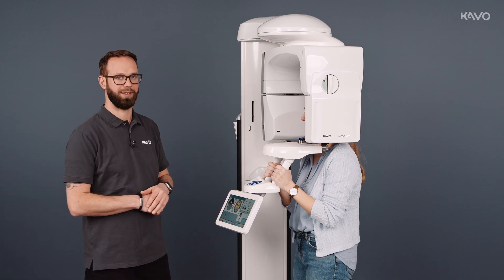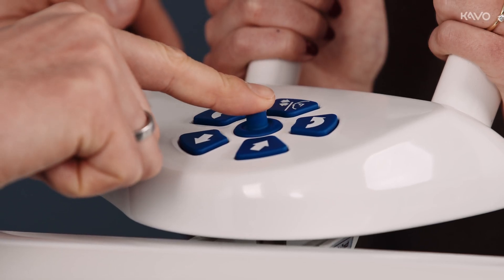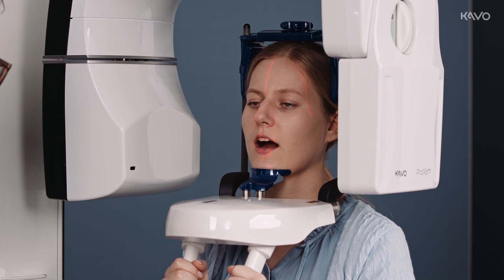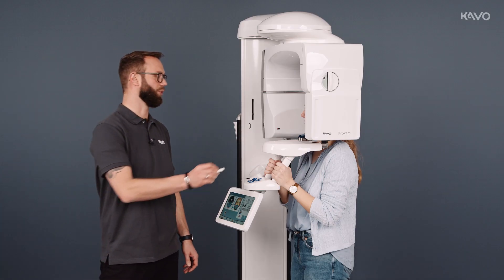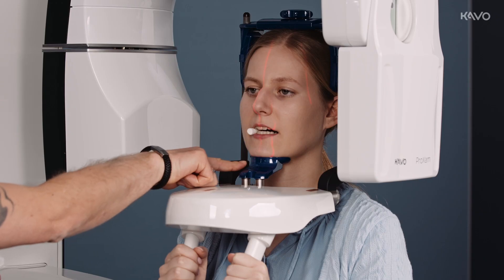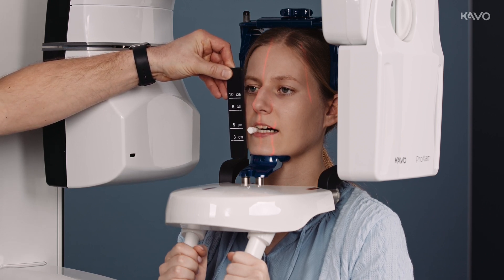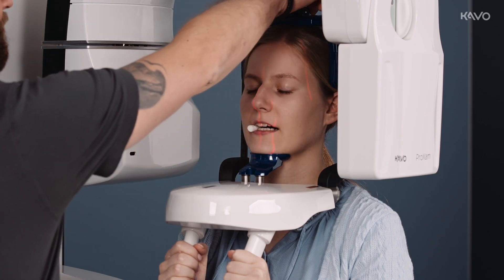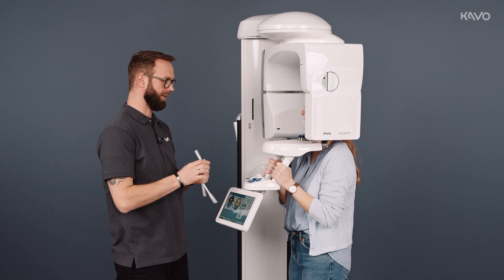Unlike 2D, in 3D we can adjust the patient on the occlusal plane. This controls the upward and downward movement of the unit, and you can switch the laser aimers on and off. The lower jaw should always be parallel to the floor. To ensure a clear distinction between the upper and lower jaw in the image, we can place a dental cotton roll between them. Down here we see the zero line — from here it goes 8 cm upwards, and this is the area that we are imaging, our volume. Now we gently hold the patient in place and use rubber bands to prevent them from wobbling.